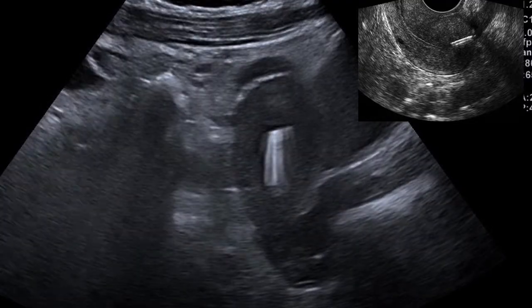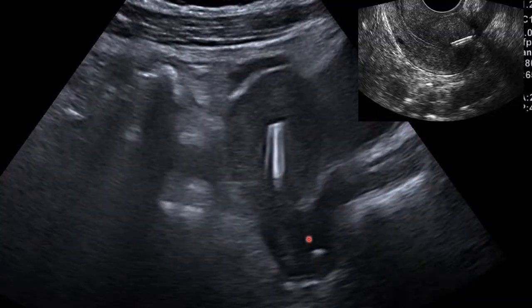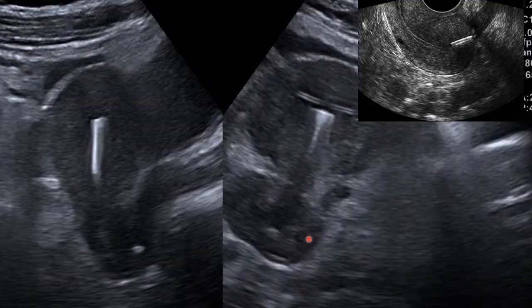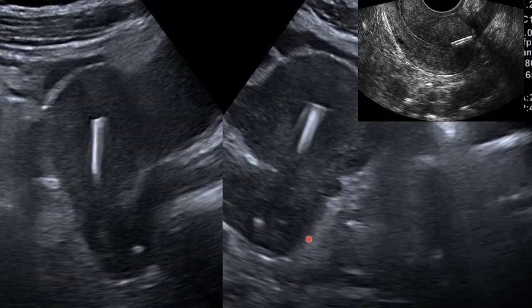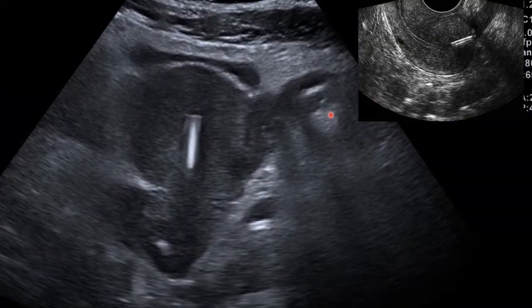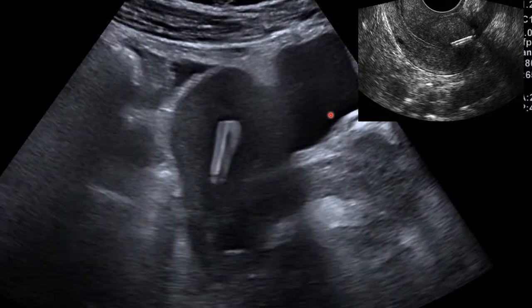So you also have to demonstrate the cervix, and check that there's nothing in the cervix as well. Then you appreciate the ovaries, the normal follicles, and the blood flow in the ovaries, to check that there's no torsion. If there's pain, then you should consider other factors even if the IUCD is in normal position.